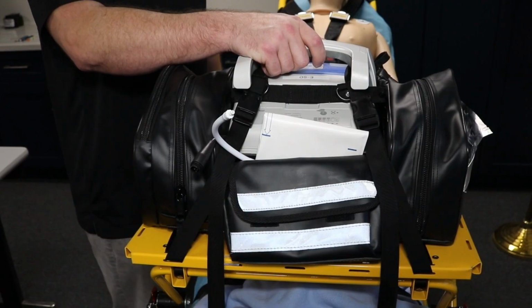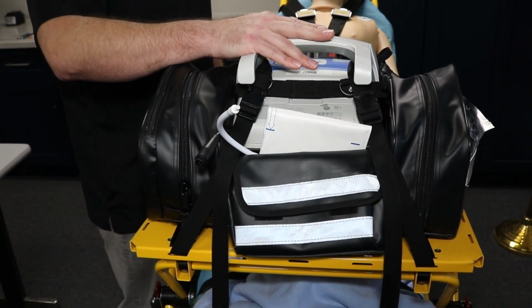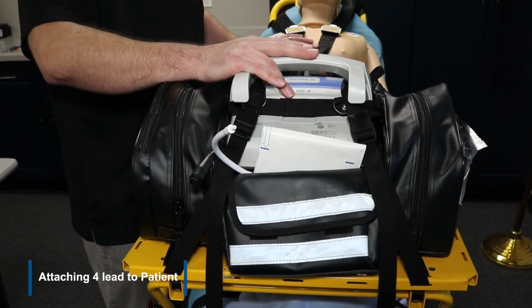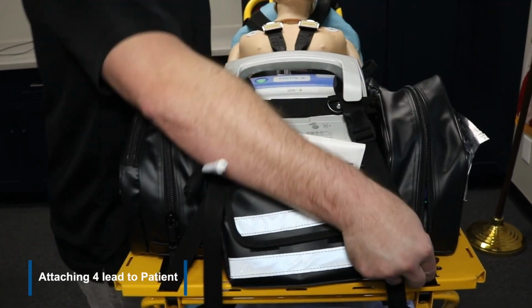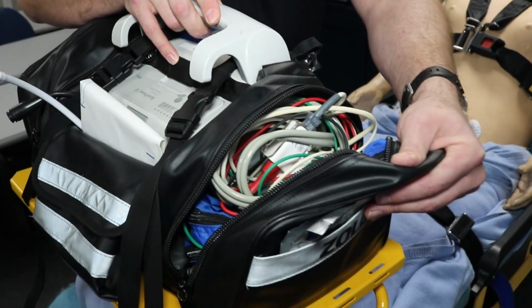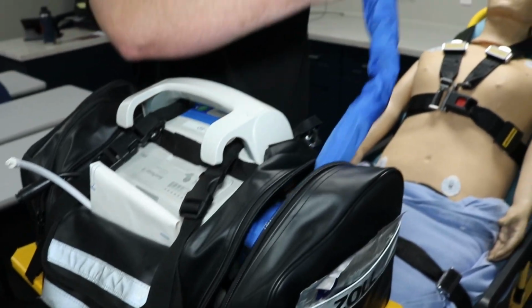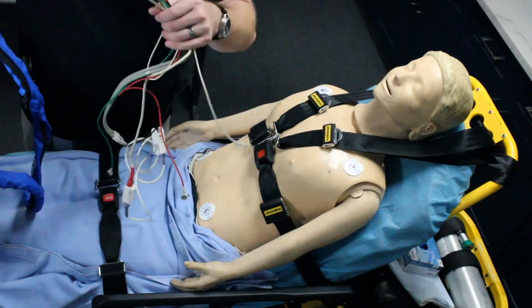All right, now that we have the tray connected and secured to the gurney properly and the monitor attached to the tray correctly using our hard points of contact, we are going to discuss how to hook up our patient to the monitor and program the monitor for our Q15 minute vitals. So one of the first things I want to do is come into this side pouch here where we keep our BP cuff, electrodes, and pulse ox. So we're going to take this out, lay it on the patient, and organize our cords here.